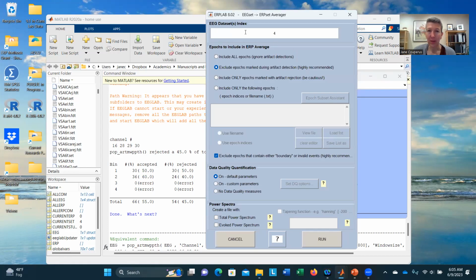And it's going to pull up this window. It's going to ask you which data set. So you could manually change the data set here, but we're using data set 4. We're going to exclude epochs marked during artifact detection. That's exactly what we just did. We just marked all those ones we said with the moving window peak to peak are artifacts. And then we're going to go ahead and just use the default parameters on this, go ahead and run.